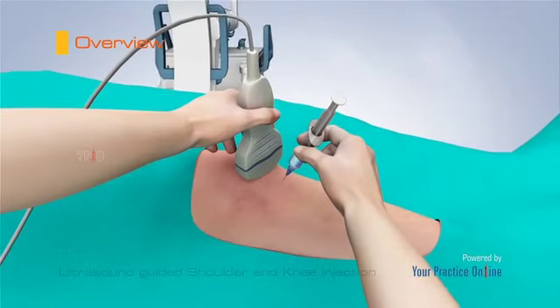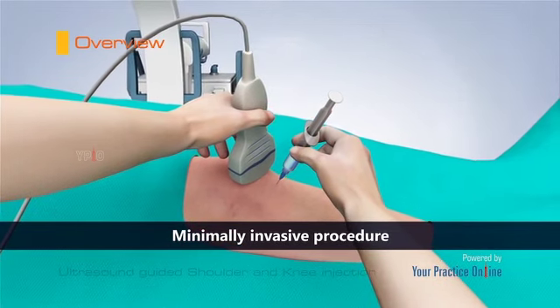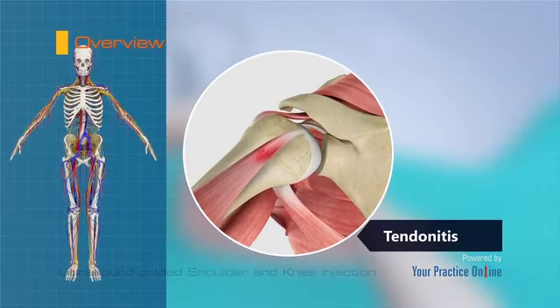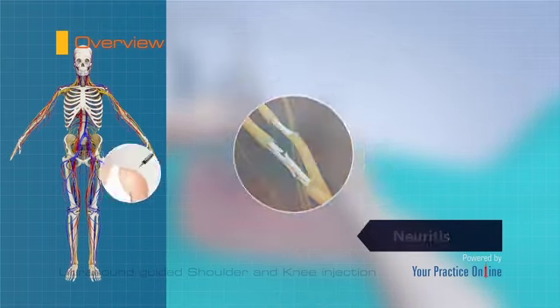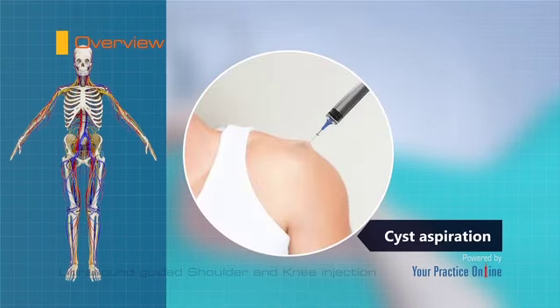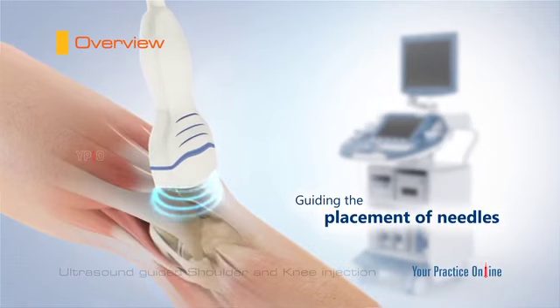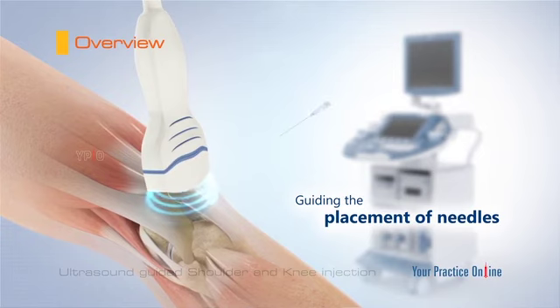Ultrasound-guided injection is a minimally invasive procedure used for treating various musculoskeletal painful conditions such as tendinitis, bursitis, and neuritis, or to perform cyst aspiration. It is also an excellent tool for guiding the placement of needles for both diagnostic as well as therapeutic purposes.